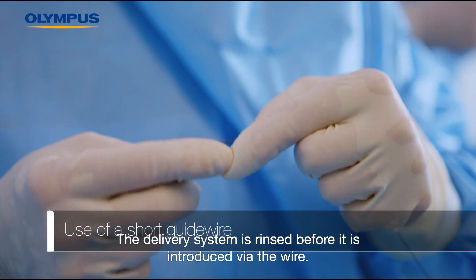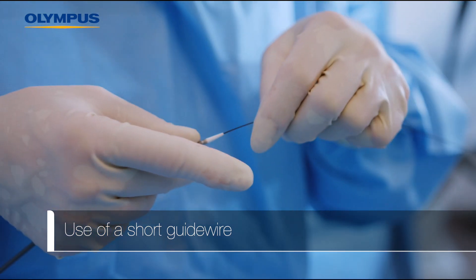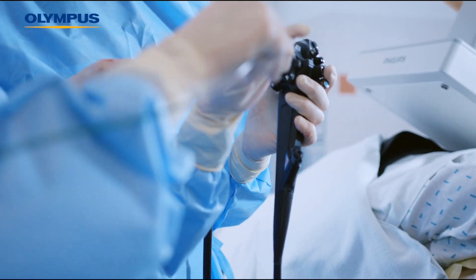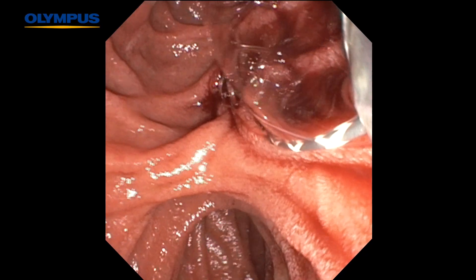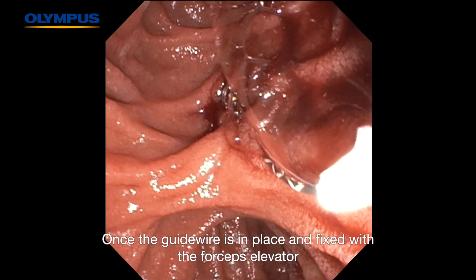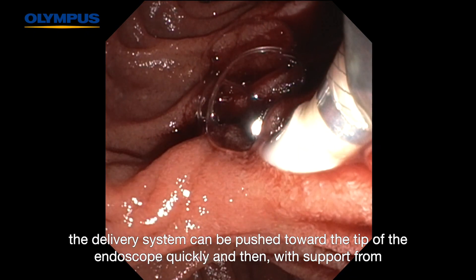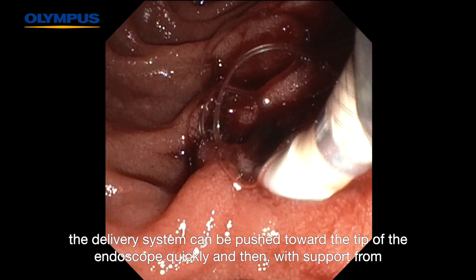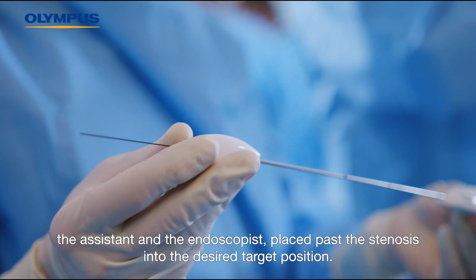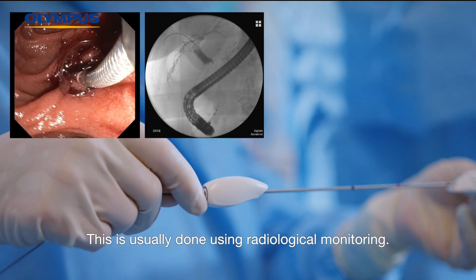The delivery system is rinsed before it is introduced via the wire. Once the guide wire is in place and fixed with the forceps elevator, the delivery system can be pushed toward the tip of the endoscope quickly, and then, with support from the assistant and the endoscopist, placed past the stenosis into the desired target position. This is usually done using radiological monitoring.